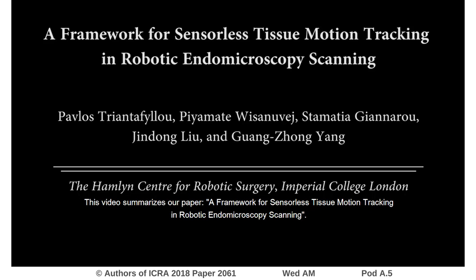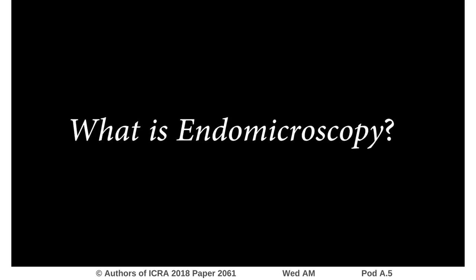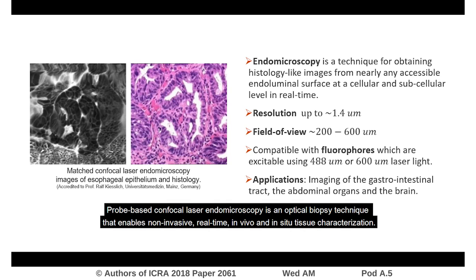This video summarizes our paper, a framework for sensorless tissue motion tracking in robotic endomicroscopy scanning. Probe-based confocal laser endomicroscopy is an optical biopsy technique that enables non-invasive, real-time, in vivo and in situ tissue characterization.